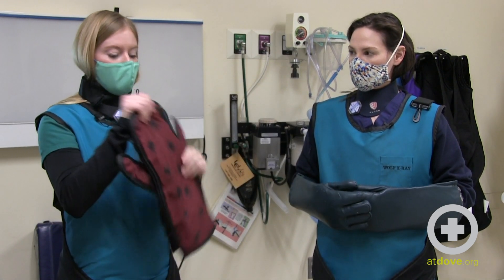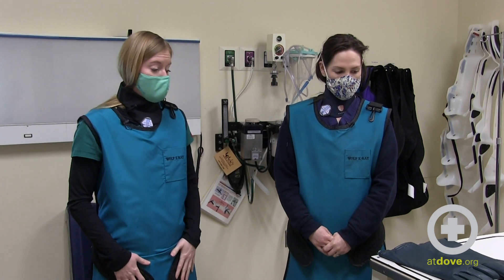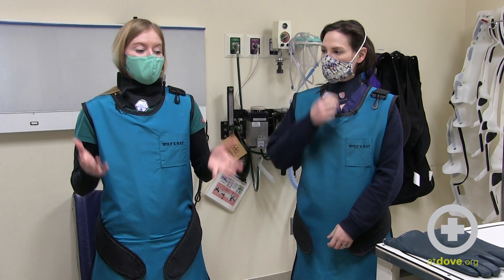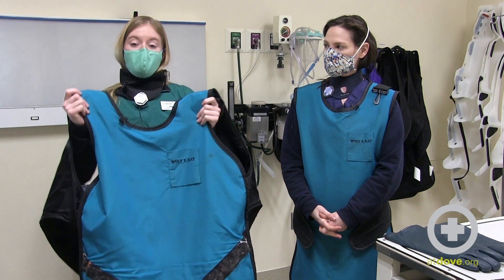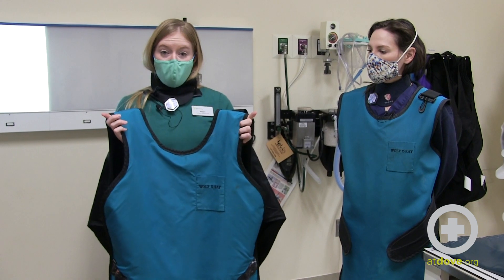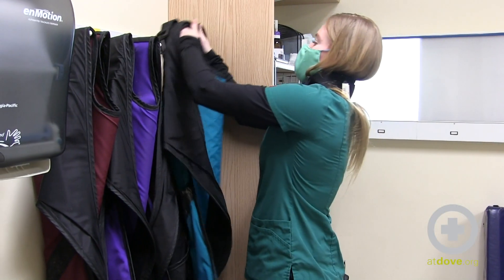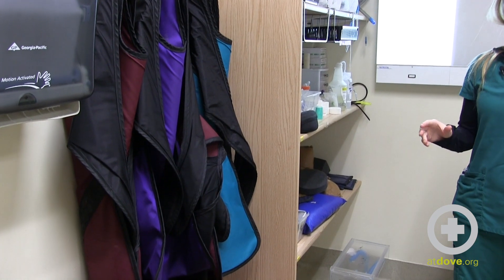Taking the gear off and storing it is just as important as putting it on properly. These pieces of PPE are all lead-lined, and lead will actually crack. Even though these are pretty flexible, if stored folded over, you'll get cracks in the actual lead that is supposed to be protecting you. You can test this by taking radiographs of your equipment — you'll be able to see the cracks in the gear if they need to be repaired. These should always be stored hanging on pegs, not bunched up on the floor, with each arm over the pegs so it hangs naturally. Avoid any tight folding, which can create cracks in the lead.